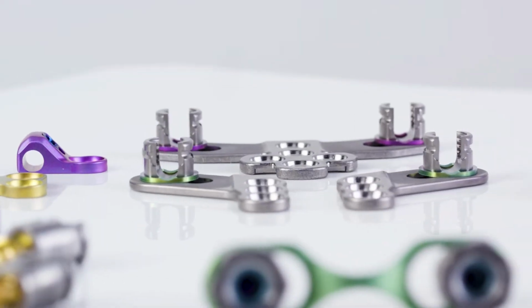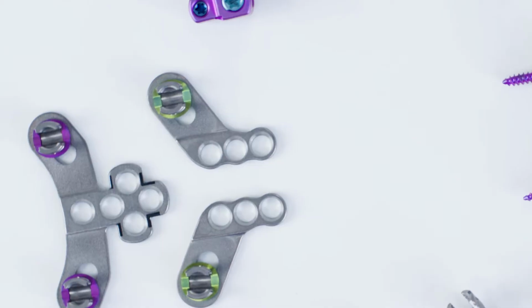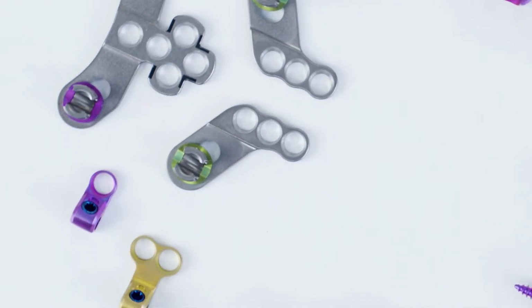The great thing about revising this is that I had a whole bunch of different kinds of occipital fixation choices. So we were able to put our plate up high, and yet the plate is designed to have the thinnest possible plate so that it doesn't interfere, because otherwise people would feel back there and say, I feel the instrumentation. So the plate is set up high, but the screws are set down low where it gets coverage by your muscles. And then we were able to pull out all of their other screws and use a larger diameter screw. So this was a 4.0 diameter screw they used in some places. We were able to use a 4.5 diameter screw.